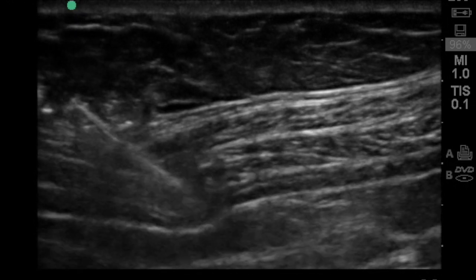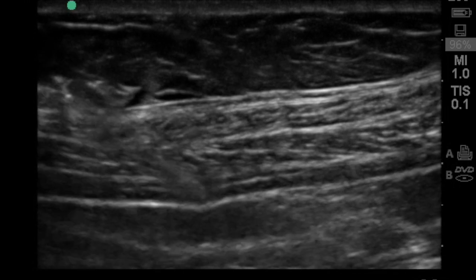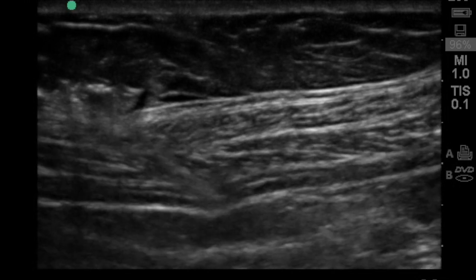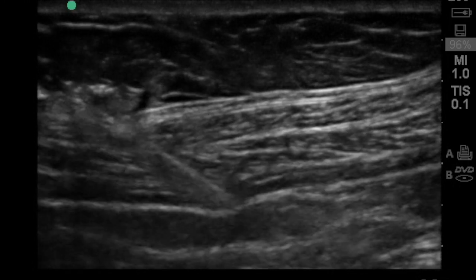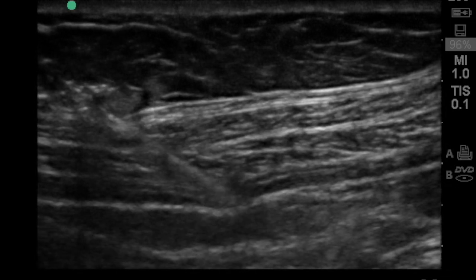Using a linear probe in the transverse orientation on the lateral abdominal wall between the bottom of the ribs and the top of the iliac crest, we see here the external oblique, internal oblique, and transversus abdominis muscles on top of one another.